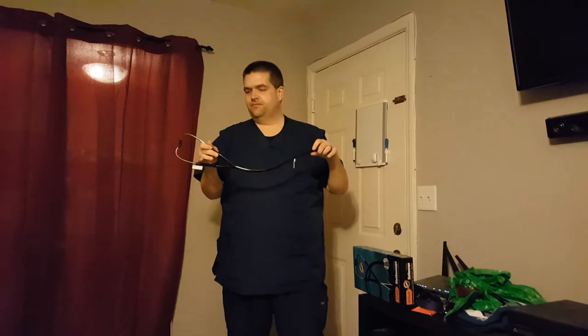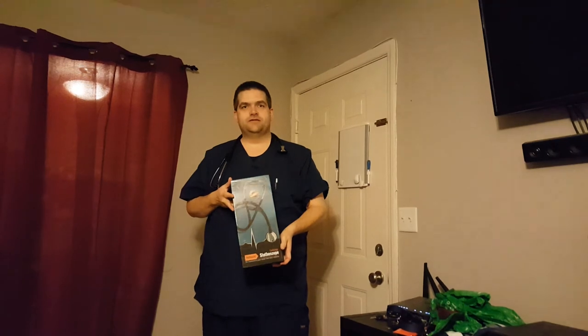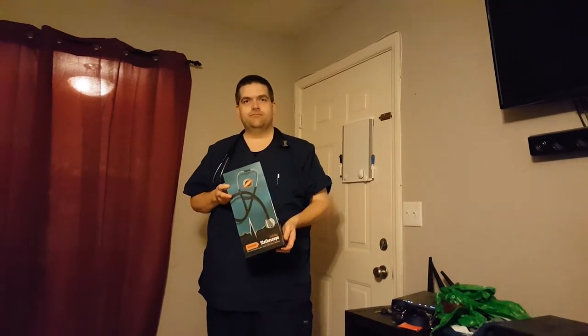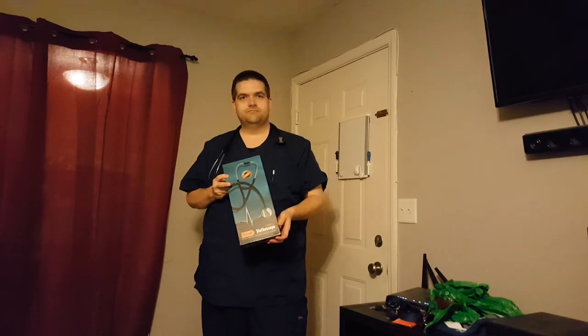Also in this case is the replaceable diaphragm. Another nice feature about this stethoscope is that it is a lifetime warranty. Should something happen to it — breaks, cracks, whatever — call them up and they can replace it. I've been seeing that this is the number one seller on Amazon right now for stethoscopes. This is what it looks like. Please check the affiliate links at the bottom and they can give you maybe a deal. Thank you.